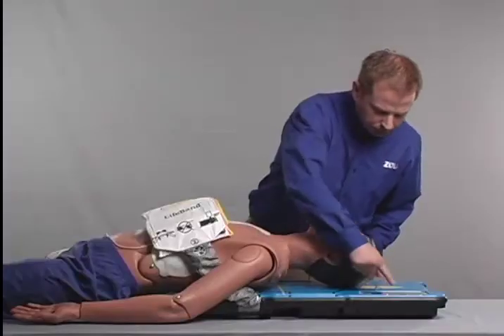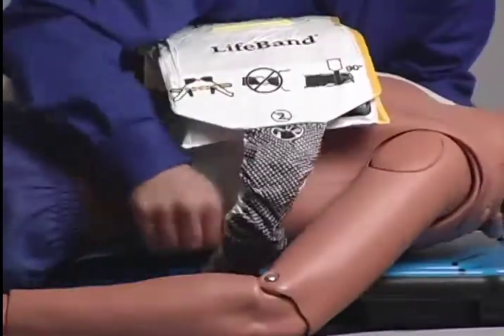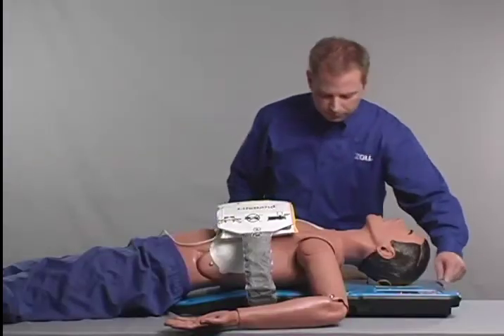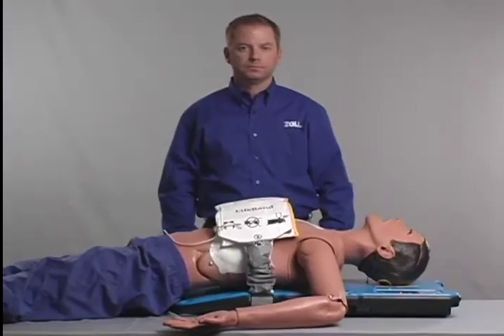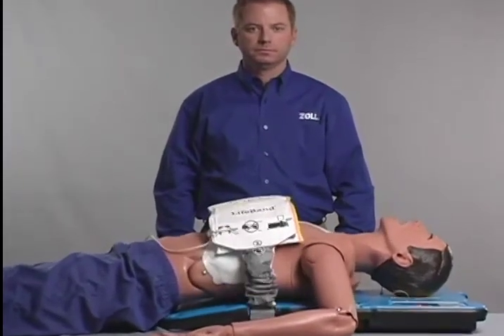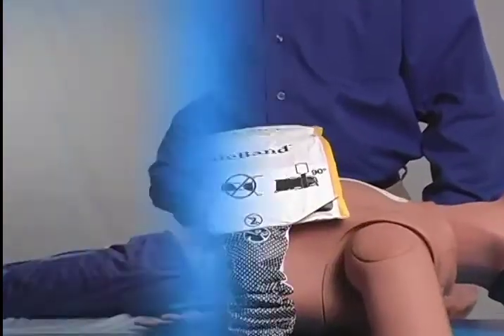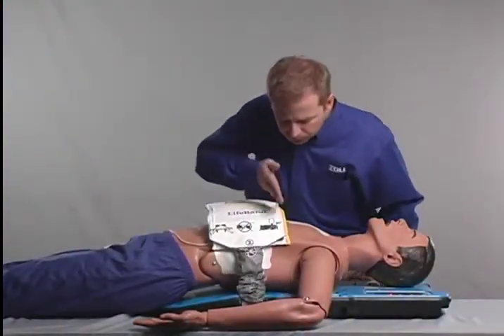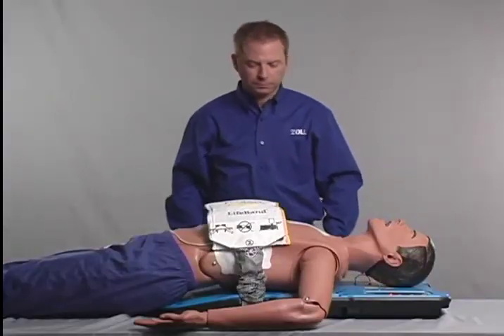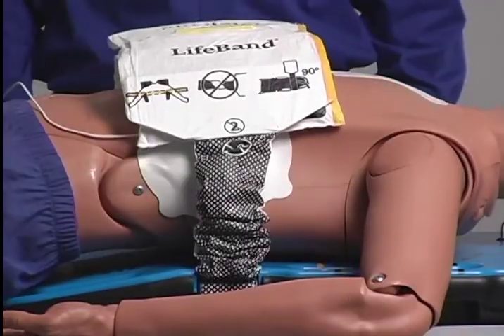If the patient needs to be realigned, press the orange Stop button, realign the patient, and press the green Continue button again. If the patient does not need to be realigned, you have the option of pressing the green Continue button to begin compressions immediately. After this three-second alignment check interval, if neither the green Continue button nor the orange Stop button is pressed, the AutoPulse will automatically begin compressions.